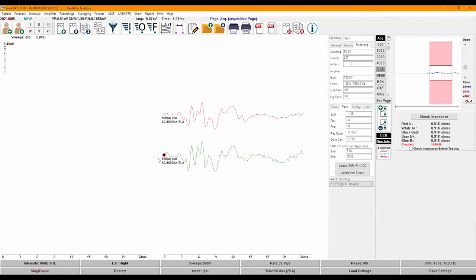When you have a recording selected and it is green, as you move along the recording, you'll be able to see where you are in time on the top of the screen. I will label the peaks as we did before while the recording is in progress. You can also adjust the placement of any peaks at any time — simply click on the label, it will become red, and then you can move the latency and amplitude markers as needed.